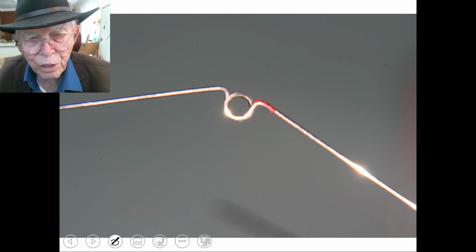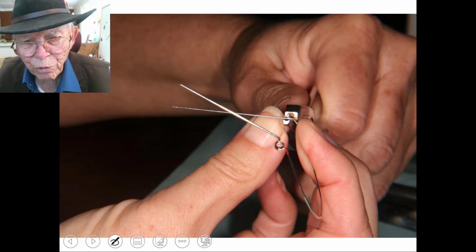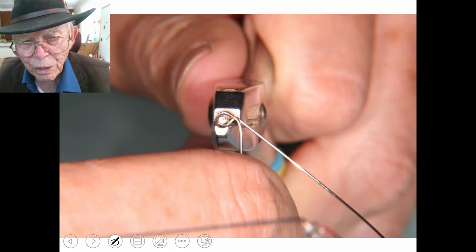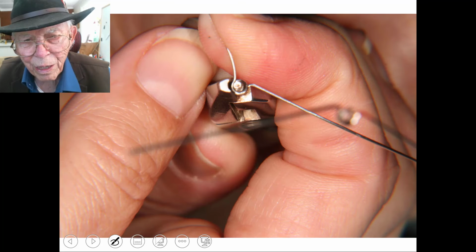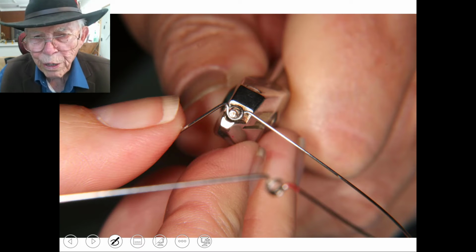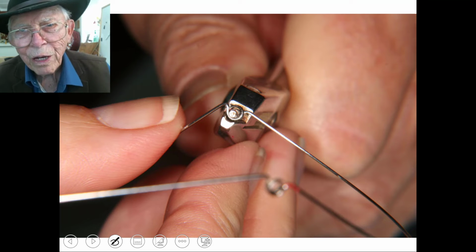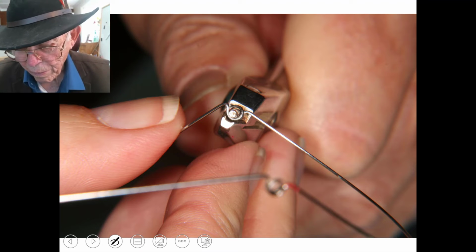All right, we finished it. We've activated it. Now we go across the way to the other side. We've got a mark over there too, and we bend it down. We go through the same process of twisting it in like that. And now we bend it, flatten it out. Now we're going to activate it. And every spring that you make, you activate it by tightening the spring up. And I want to illustrate that.